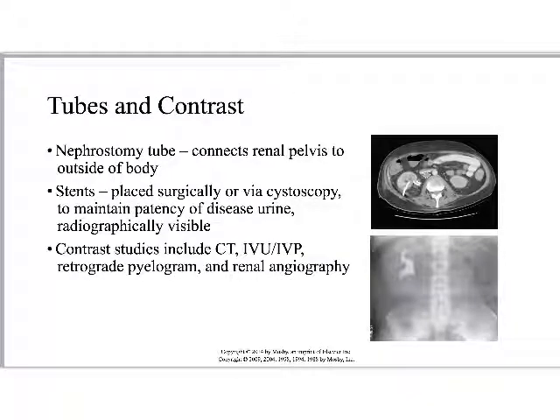All right, tubes and contrast stuff. Turning the page here. Let me see, tube page.